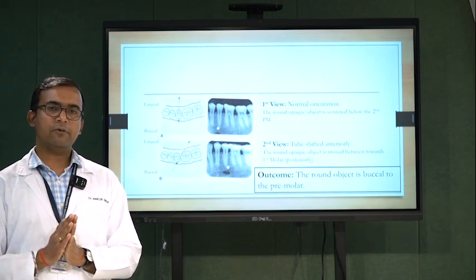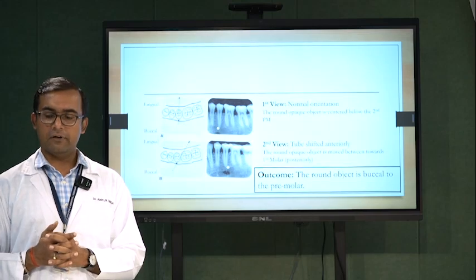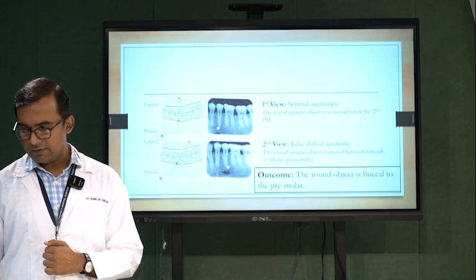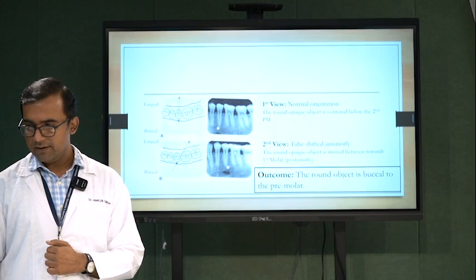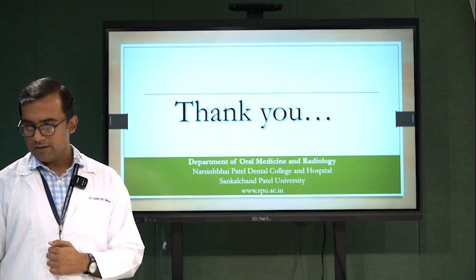So in that case, it's the third scenario where the object will not shift, but if it is shifting, we have to use the SLOB acronym. So that's it for the lecture today, and these are the references that I have used.